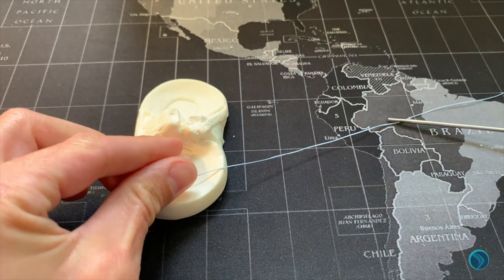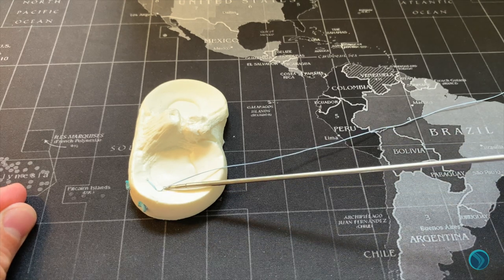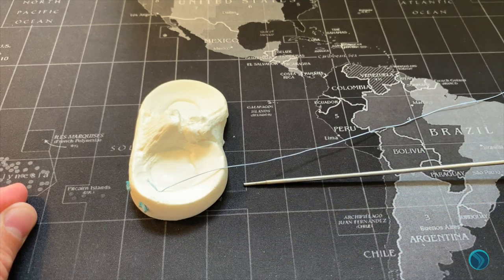Feed the single tail through the cutter and divide the leftover remnant, completing the meniscal repair.